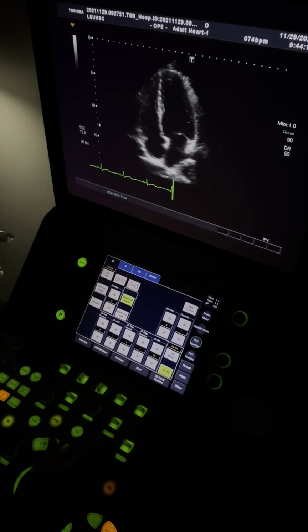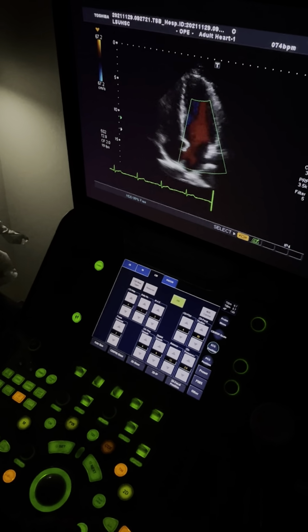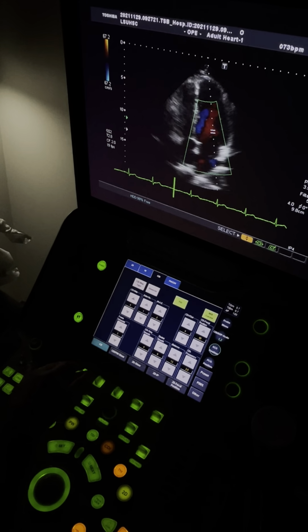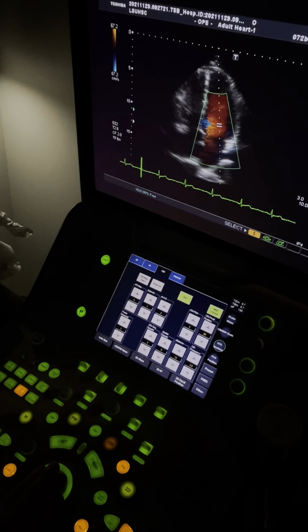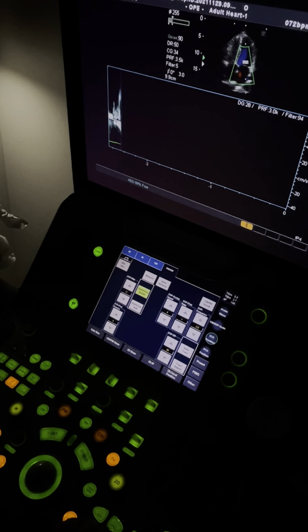No, let's not go to, let's go on to color flow at the mitral valve. I'm going to call up my gate. I want my gate size down to be about 3. I will tell you I tend to go even smaller than that, but 3 is what you think. What's odd.